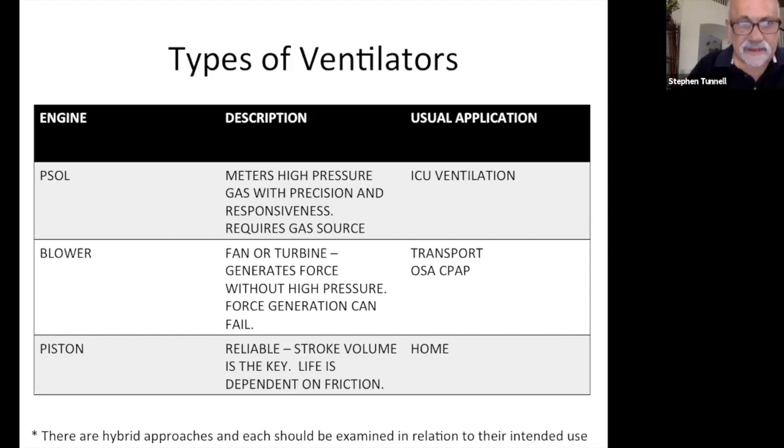When I say PSOL, I'm talking about a set of solenoids, a set of valves that open to a particular level and allow oxygen and air to be mixed and then to be delivered into the ventilator circuit and to the patient. And we'll look at a terrible drawing by me of what a ventilator and circuit and patient might look like.